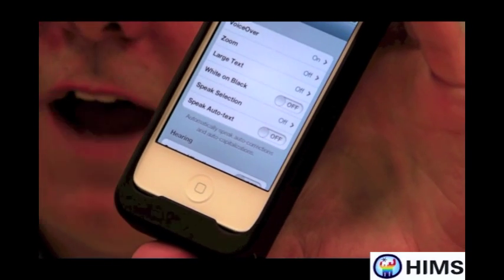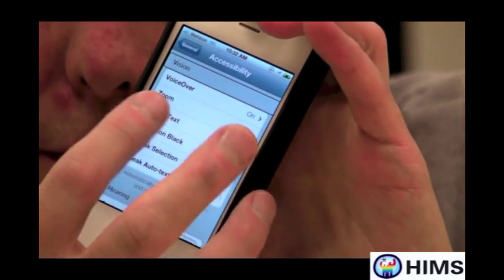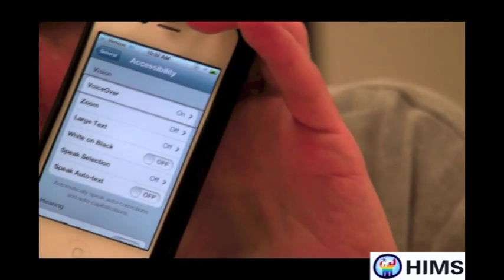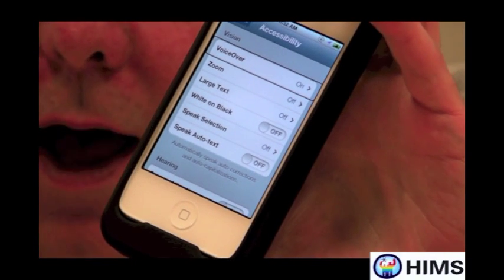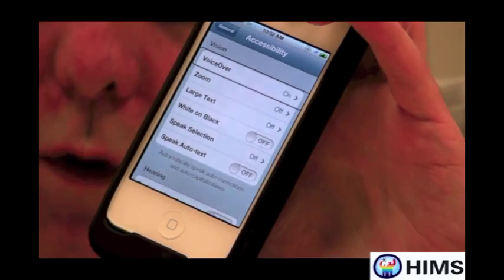Luckily, one of the first items under Accessibility is VoiceOver. So I'm going to flick over to VoiceOver. It said 'VoiceOver on' — that's great, that simply means that VoiceOver is now working. And so now that it's working, I can double tap on it, and instead of turning it off, it will go into VoiceOver settings.